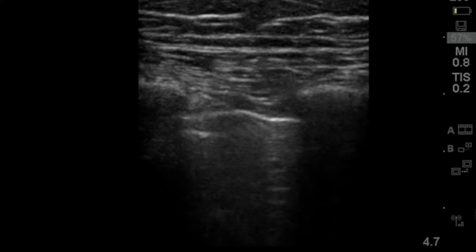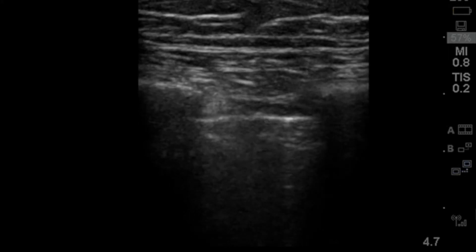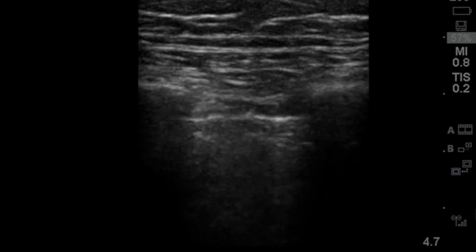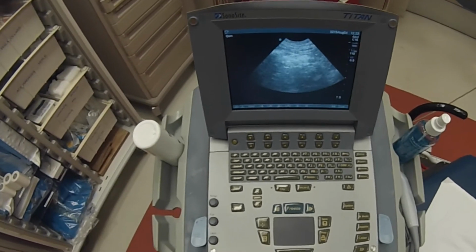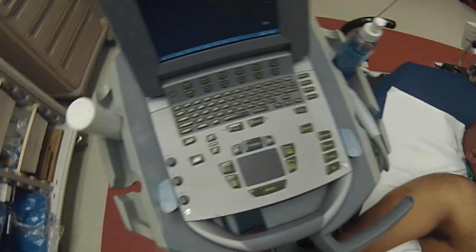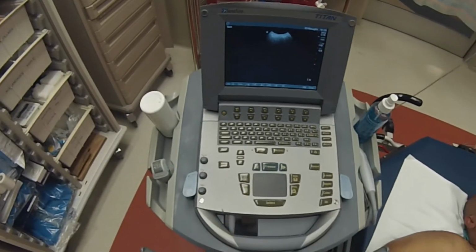We will go over pneumothorax specifically in the lung section of the website, so stay tuned for more of that coming later. So there you go. That is the extended FAST scan. There are, of course, lots of nuances that will require practice and lots more to learn about the FAST scan than I could show in this video.